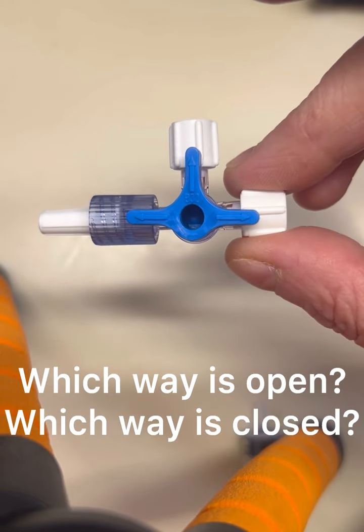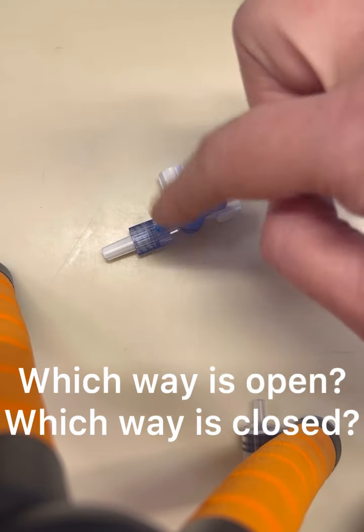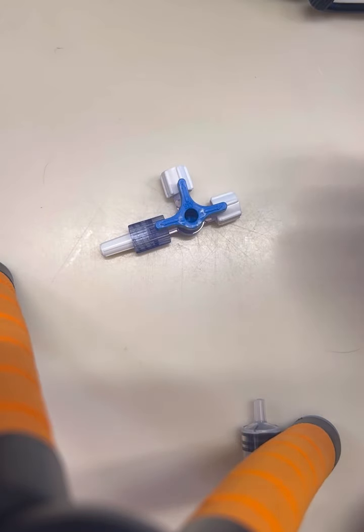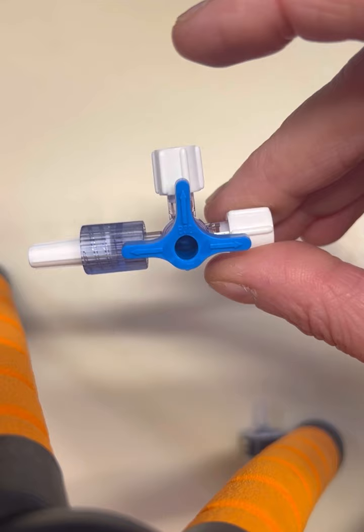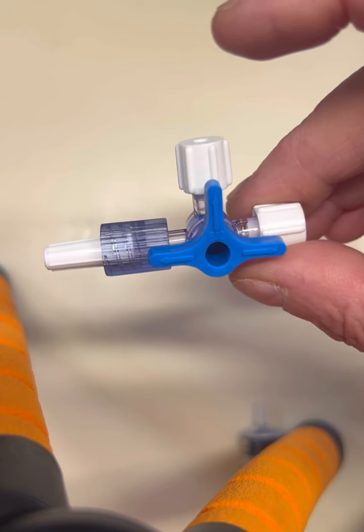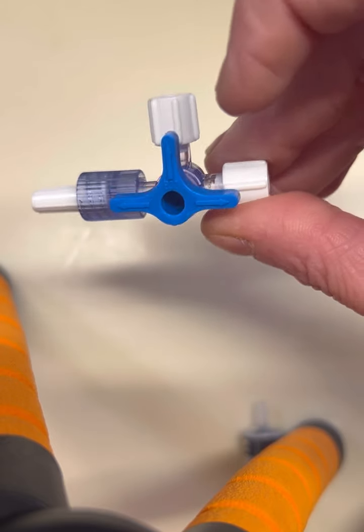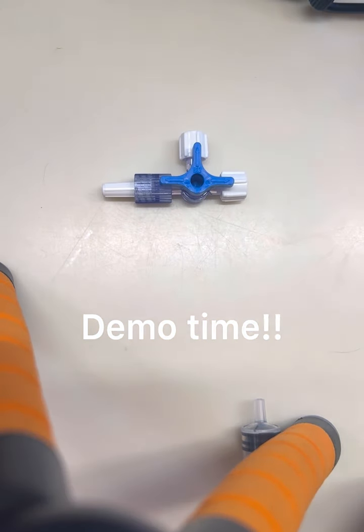Let's take a look at the three-way stopcock I do not like. The one that I do like has a white mechanism and only one arrow, making it significantly easier for you to troubleshoot. This one has three arrows and a blue mechanism. Here's what you need to know — each one of these arrows means open. So all three of these ports are now open. Let's go ahead and do a demonstration.